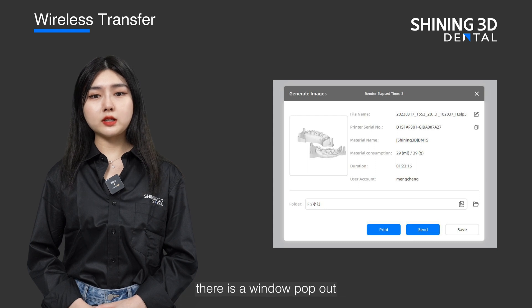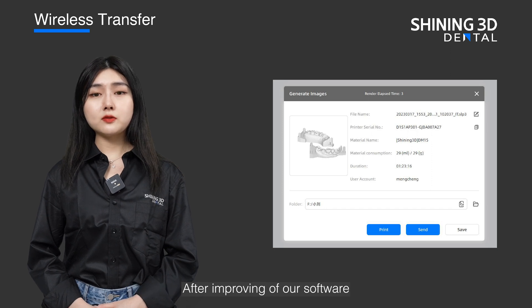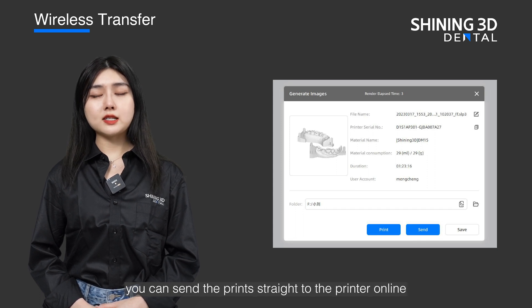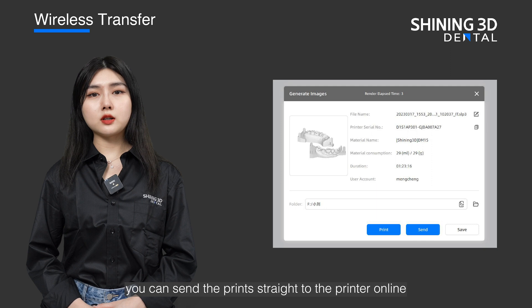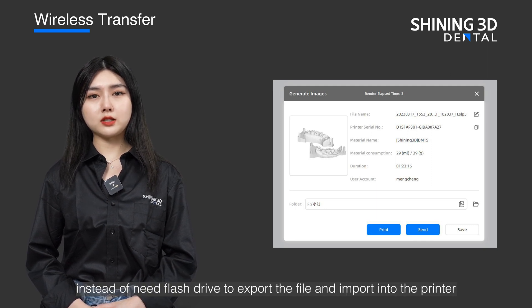After all the one-click printing, there is a pop-out window. This means you can send the prints to your printer. After improvement of our software, if you can connect Shining's printer to the wireless network, you can send the prints straight to the printer online, instead of needing a flash drive to export the file and import it into the printer.